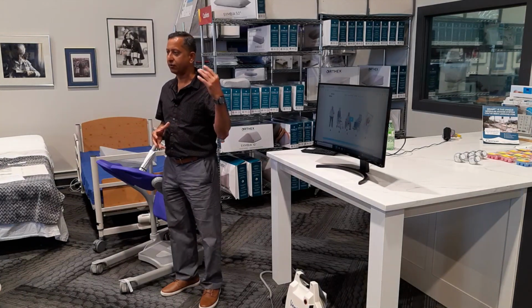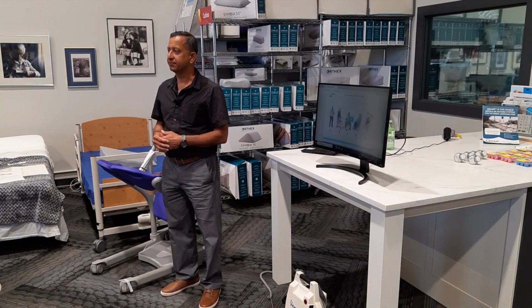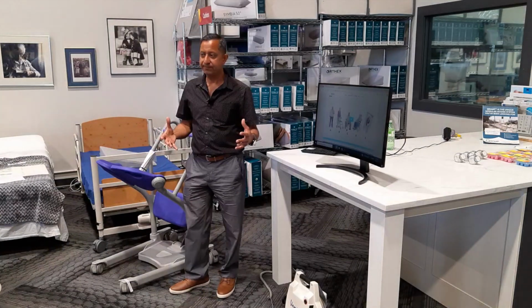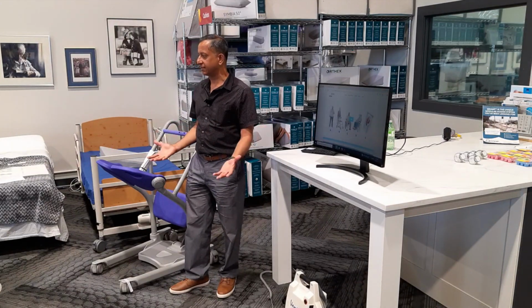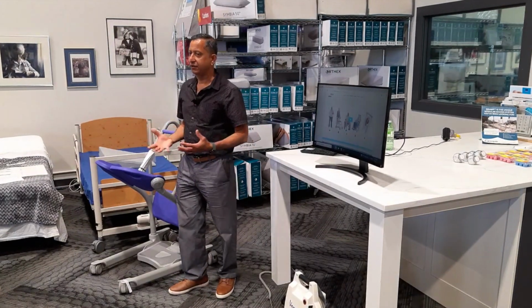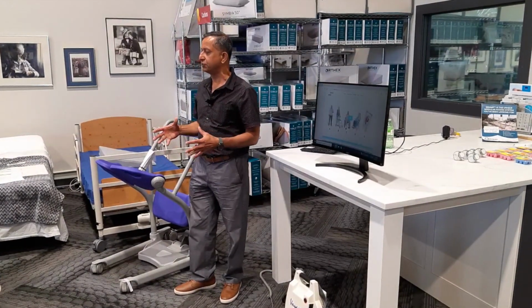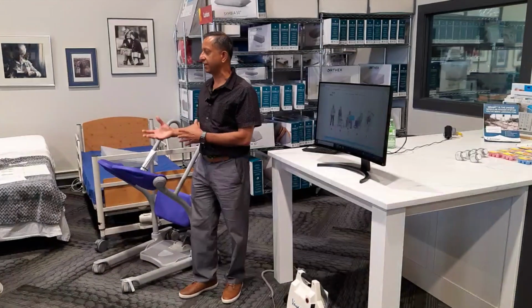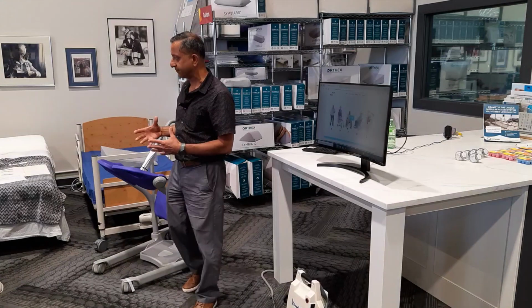If you are in long-term care or group homes, assisted living, they sometimes use bathing systems. So we have different types of bathing systems. They are longer tubs that can go up and down. And all these products are manufactured to reduce any kind of injuries to the caregiver, and provide the best comfort to the resident.